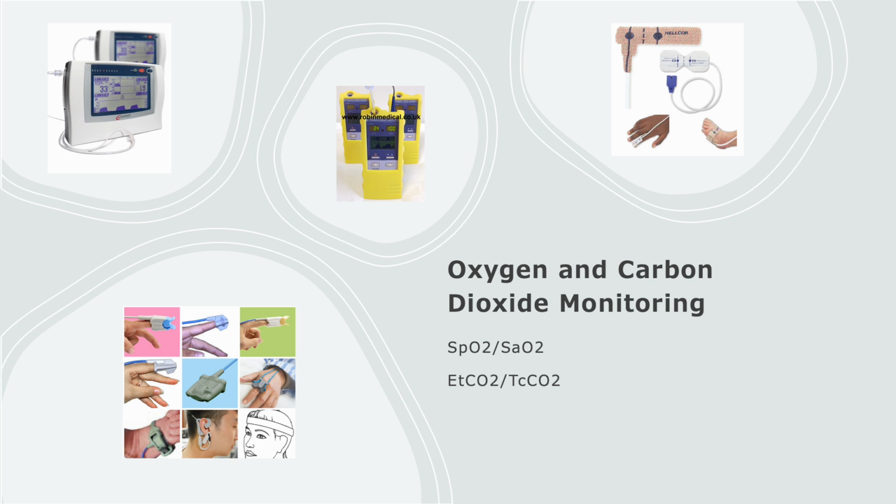If your blood is 100% saturated with oxygen, the SpO2 would read 100%. You will not see many hundreds or even 99s. Usually those are artifact in the sleep lab. It's just too high. You really just don't see that. 96 to 98 is very good.